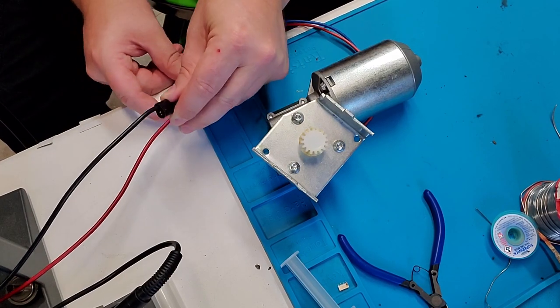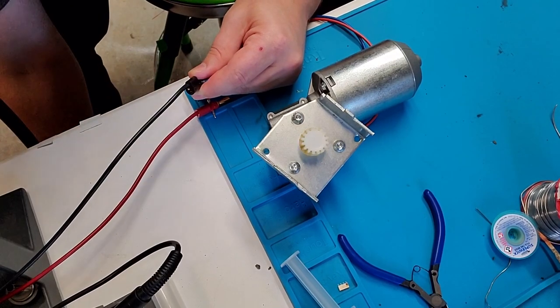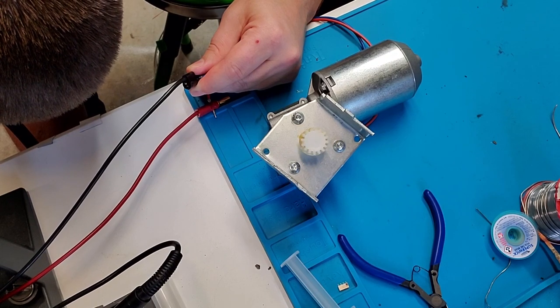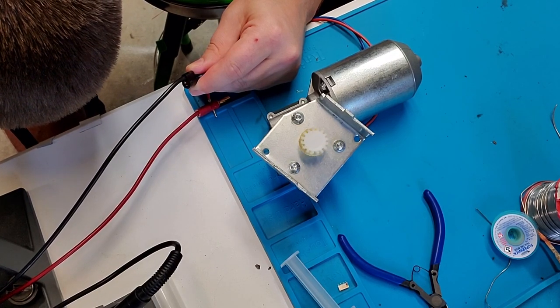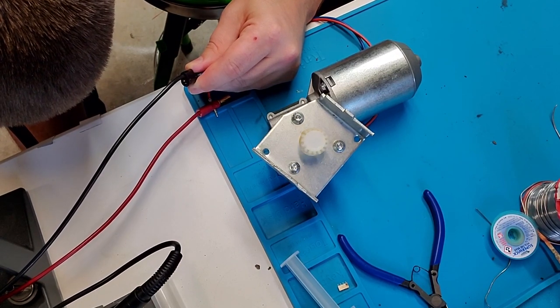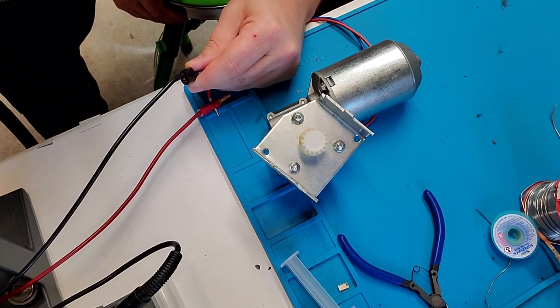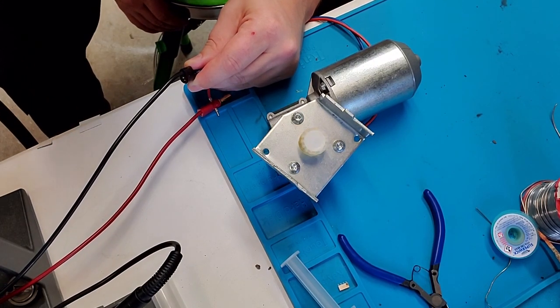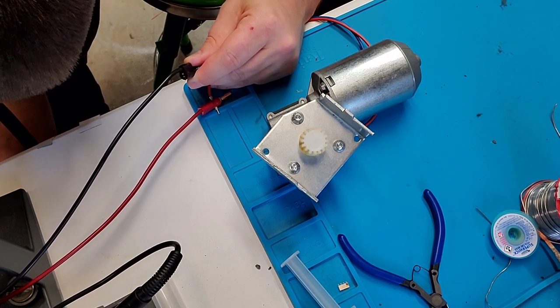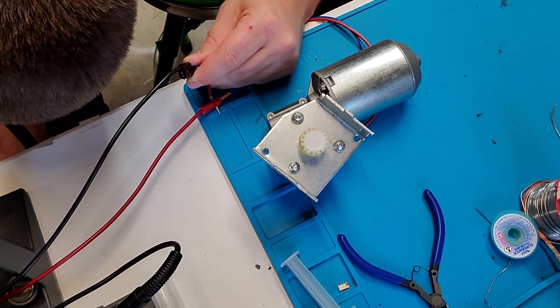Okay, so that's sounding pretty normal. This is at 12.7 volts. Let's go ahead and turn it up. It is a 24 volt motor. That's 23.9, and I'm pulling 1.7 amps. I'm messing around with the voltage to see if the amperage changes. Remember, as the voltage goes up, technically the amperage should go down.